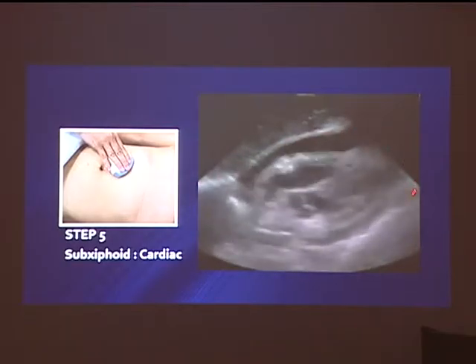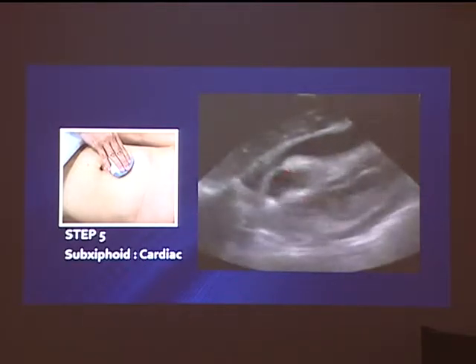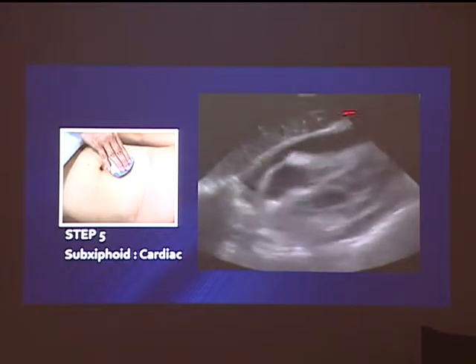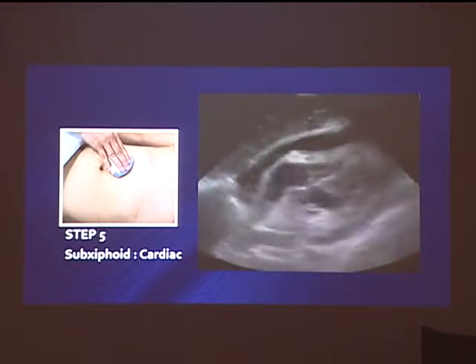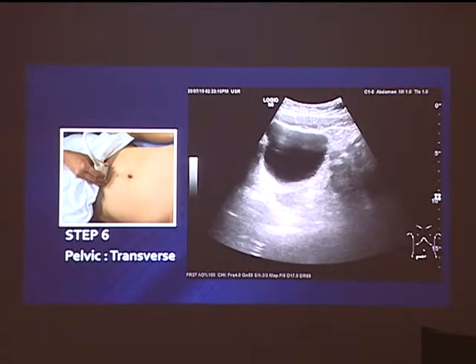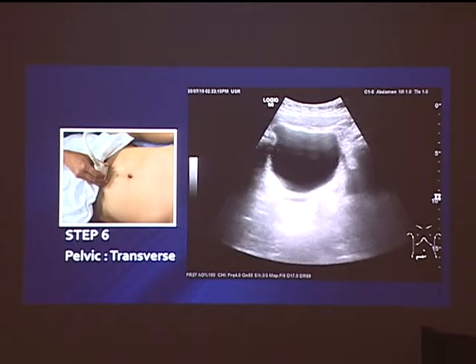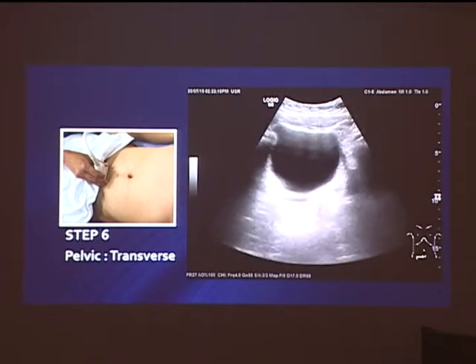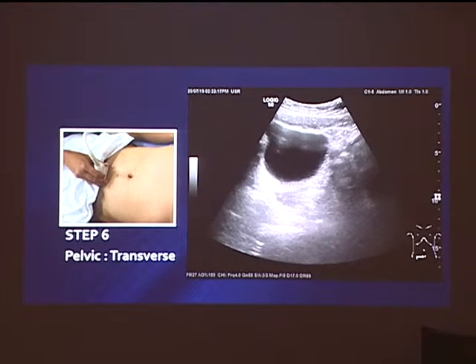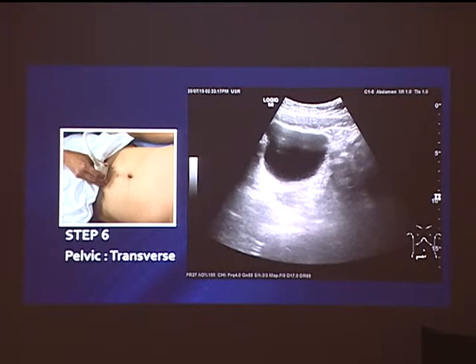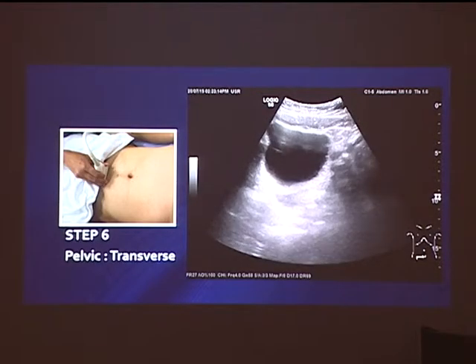Sub-xiphoid: hemopericardium with a tamponade effect. You can see how the ventricular wall is collapsed and squeezed to one side — it can hardly expand. This is pericardial effusion with a tamponade effect. The pelvic view in this patient shows a collection of fluid around the bladder. It's very important to scan thoroughly, because sometimes a patient with abdominal trauma walks into your clinic and when you scan, the upper quadrants may be negative while the fluid has collected down in the pelvis.